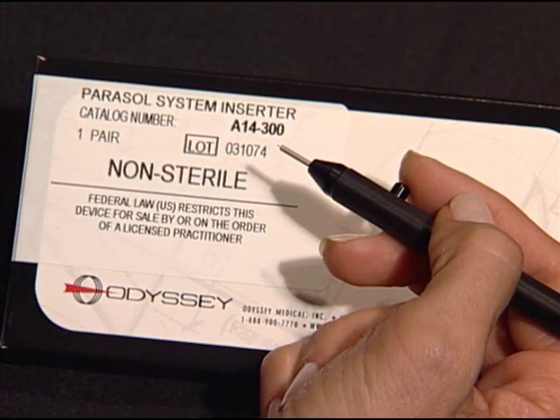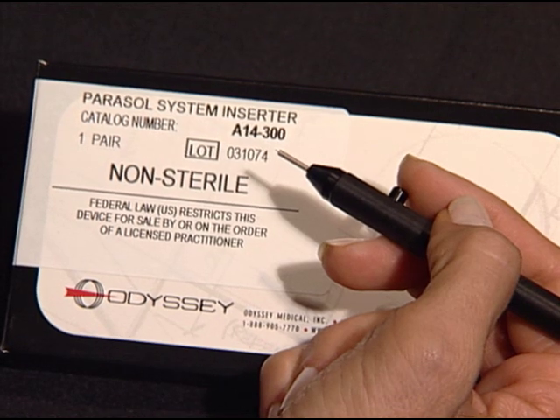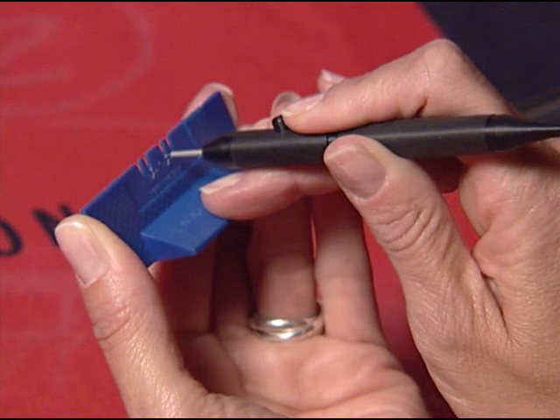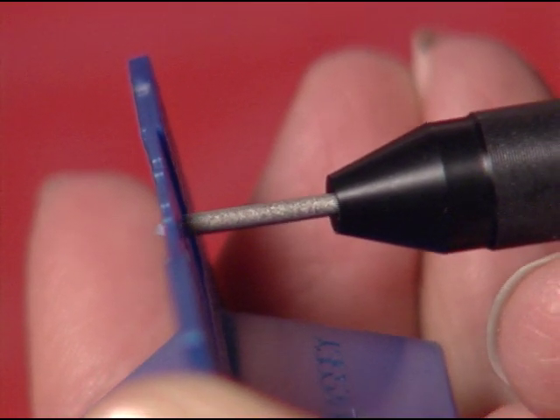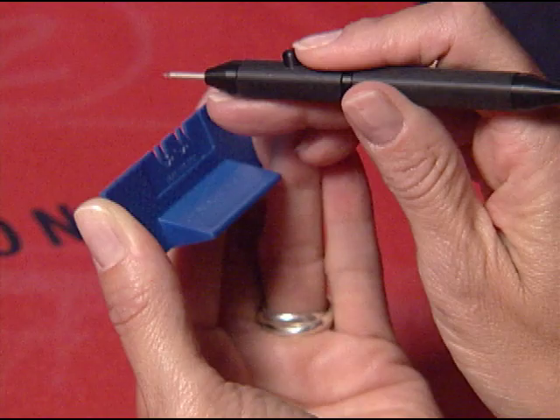Reusable insertion instruments are sold separately for use with the sterile quick load and non-sterile bulk packaging configurations. To load an occluder onto the inserter using the quick load plug stand, gently guide the inserter pin into the hole on the dome end of a plug. Then slide the inserter up and away from the plug stand.